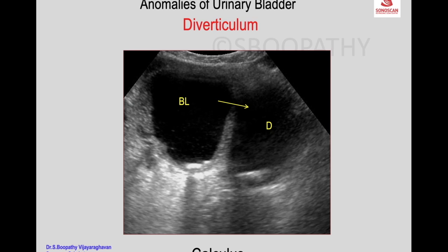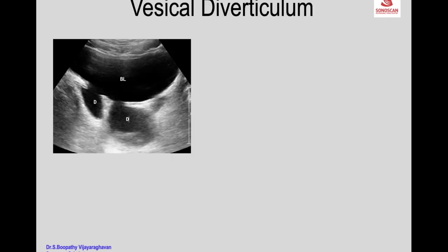The diverticulum may be associated with calculi. On transverse scan, a calculus is seen within the bladder and also within the diverticulum at its communication. There may also be hematuria as a result of bleeding in the diverticulum.